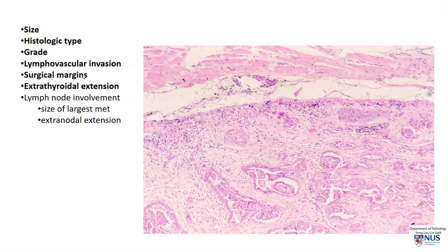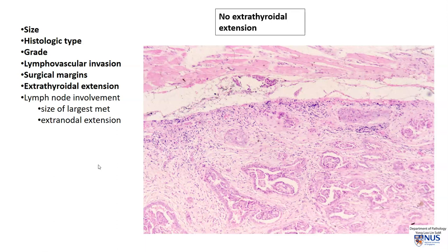The next thing we want to look at is whether there is extra-thyroidal extension. Sometimes when the surgeon has difficulty clearing the tumor, he will also excise a little cuff of the adjacent skeletal muscle or soft tissues. And in this instance, when we examine this microscopically, here is the skeletal muscle. There is no tumor involving the skeletal muscle, so there is no extra-thyroidal extension.